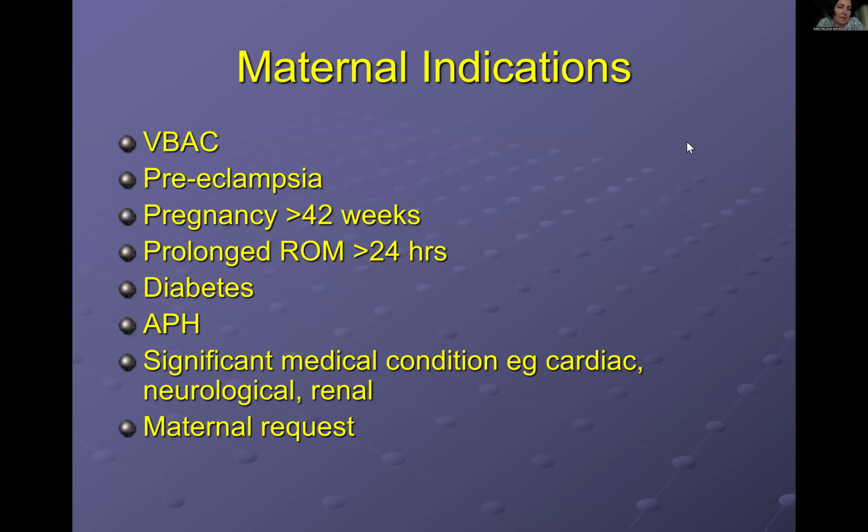To be honest, that doesn't really happen that frequently, because you can understand that being stuck to the electronic fetal monitoring does mean that she has reduced mobility. It's not usual that the mother requests it; it's usually from the medical point of view that it is requested.